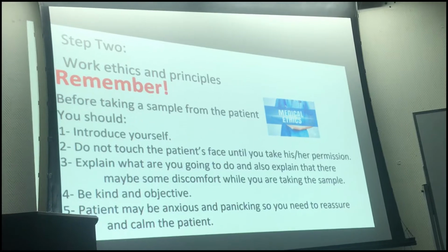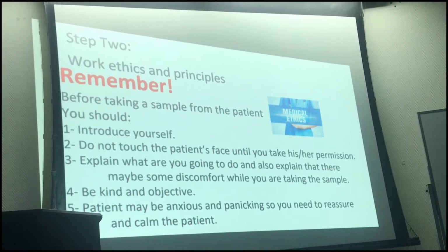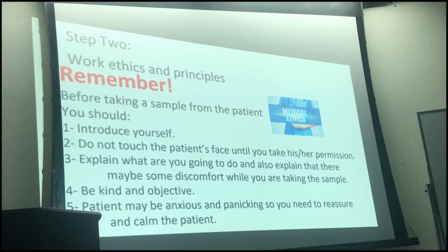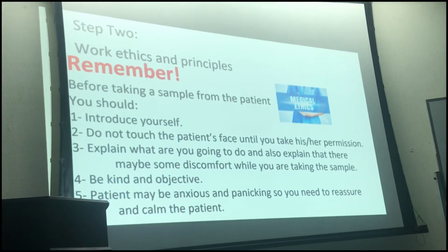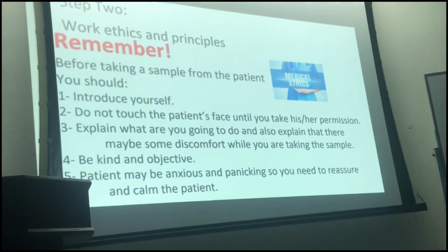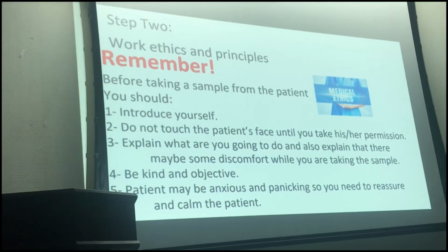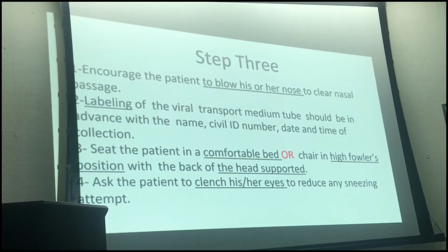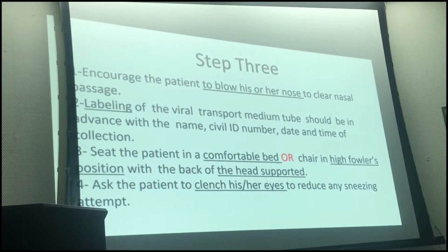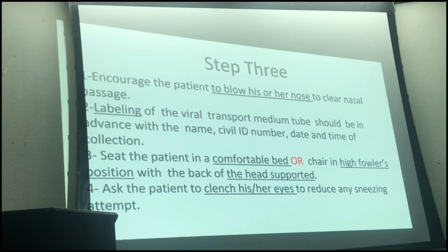The patient may be anxious and panicking, so you need to reassure and calm the patient. Usually the patients are febrile, complaining of hypoxia, and they are usually not in their normal state, so you need to reassure them and calm them down. Step 3, encourage the patient to blow his or her nose to clear the nasal passage.